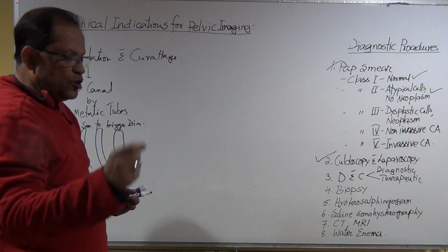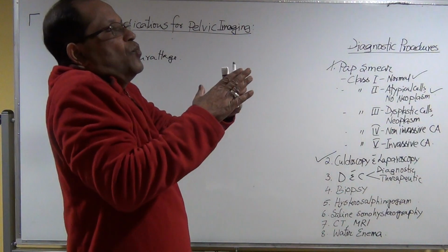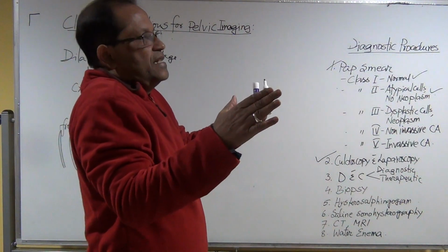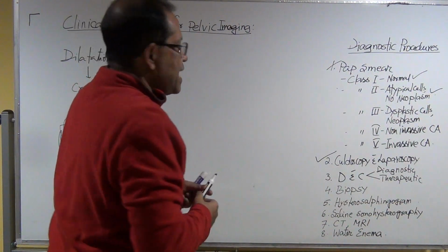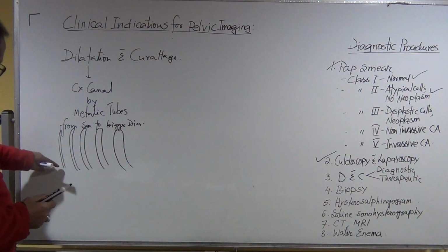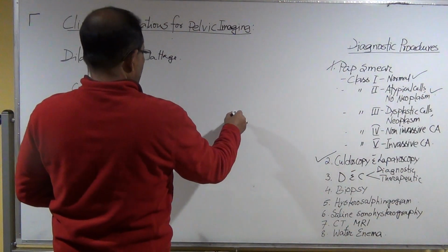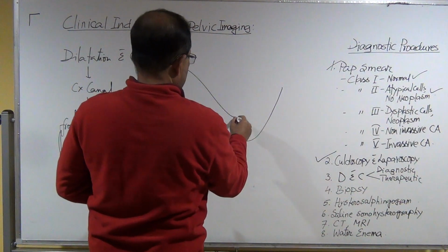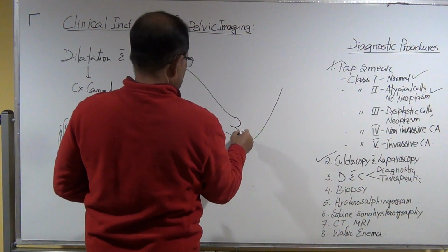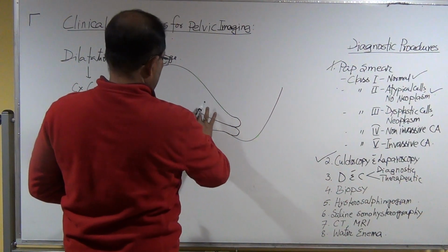Okay, in order to prevent the injury, you have to make easy dilation of the cervical canal. That's why you're gonna insert this small diameter instrument first through the external os.